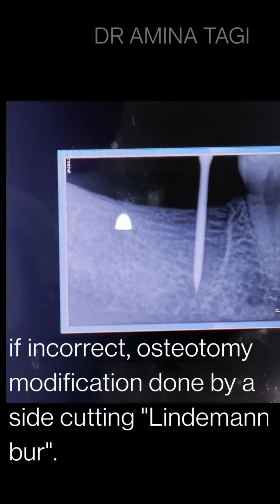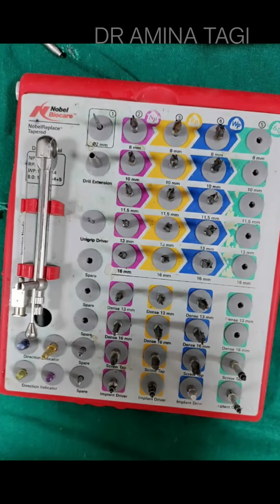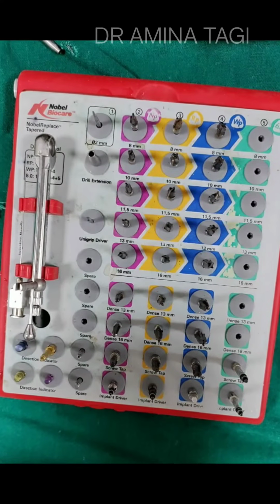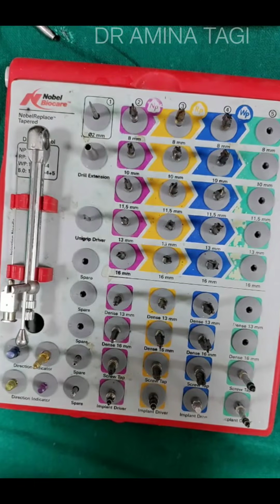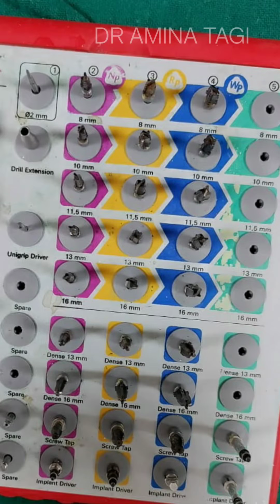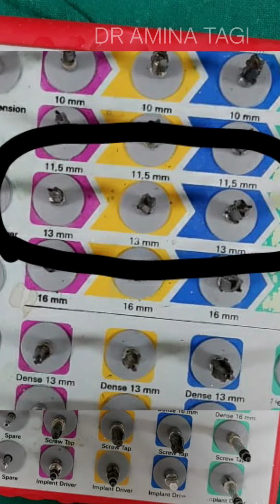So now that we are done with our pilot drill, let's come to our final shaping drills. Since our implant was of 13 mm length and 4 mm diameter, you can see in the implant kit various lengths are written like 11.5 mm, 13 mm. So we are going to choose the 13 mm length. You can see the color coding pink, yellow and navy blue. For the 13 mm coding, I have also marked it with a circle so that it will be easy for you to understand.